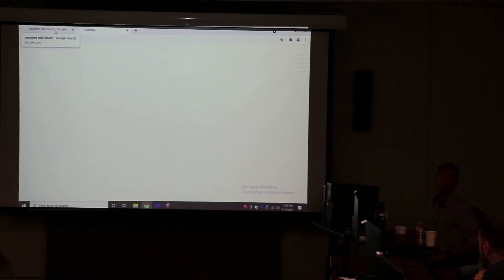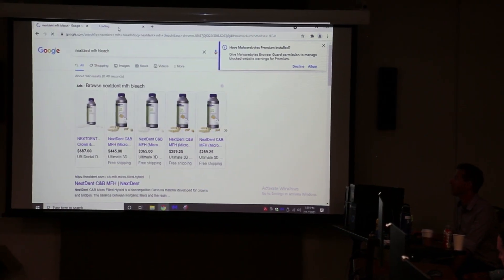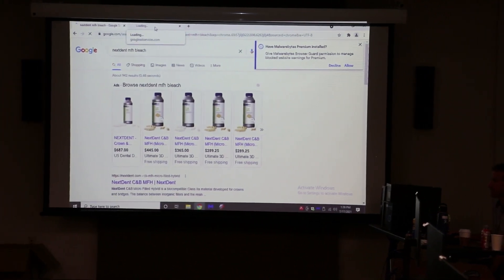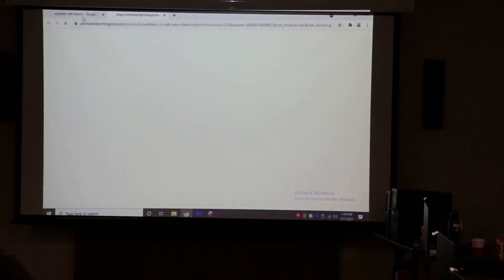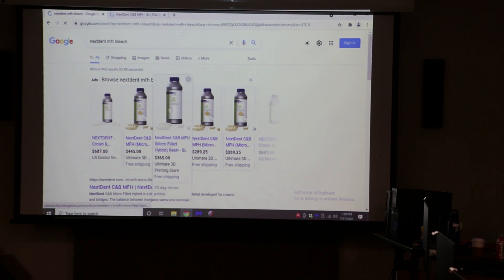The only resin they won't print is the Bago. The newest material on the market for printing hybrids wouldn't be printable on the MoonRay. This here is NextDent MFH Crown and Bridge bleach shade — this works great for printing dentures. It's $365 a liter, which is a bit pricey compared to model resins at $150.